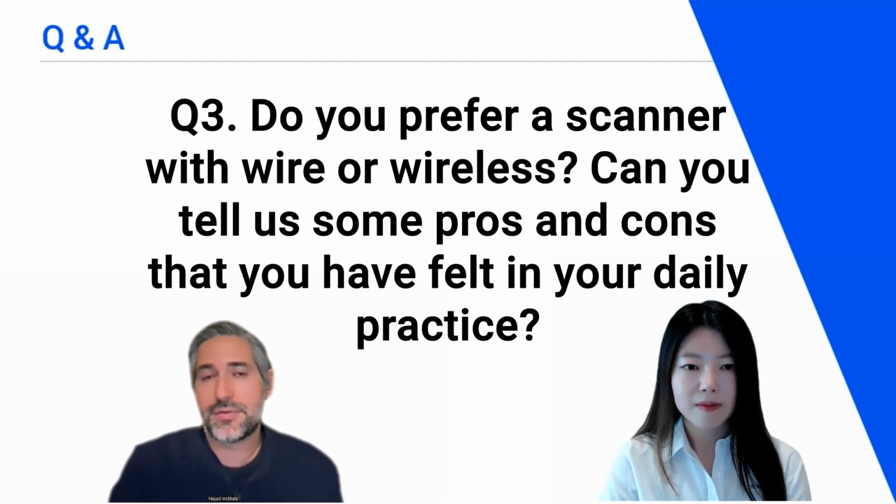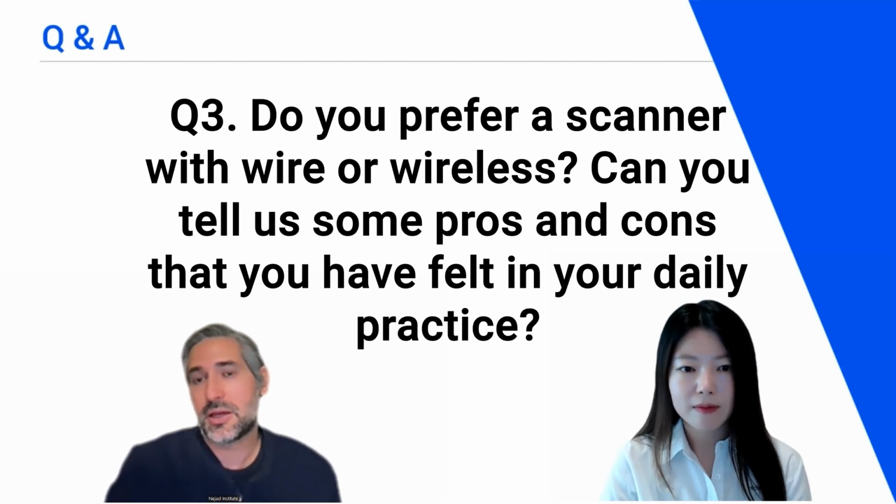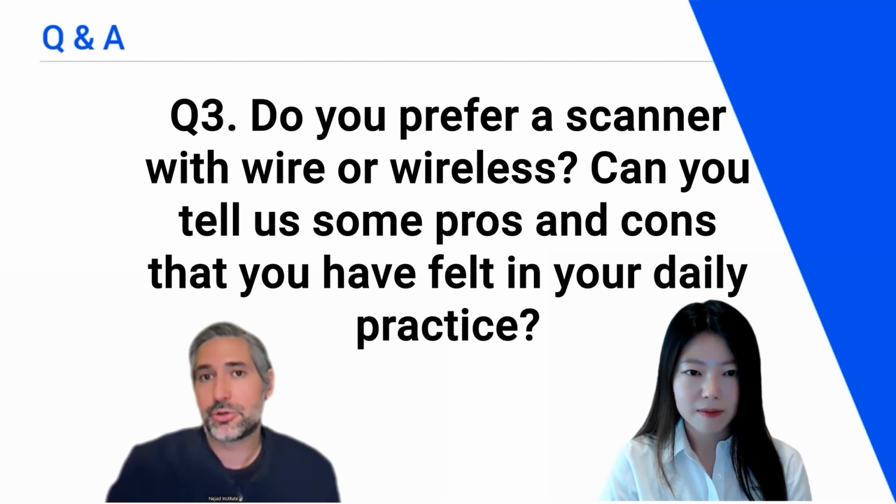And you can even have it set up to easily connect between computers in different rooms if you get different hubs, and it gives you that type of mobility. So I think that's what I would go with. I don't really see any major con to the wireless today in the form that it is now.